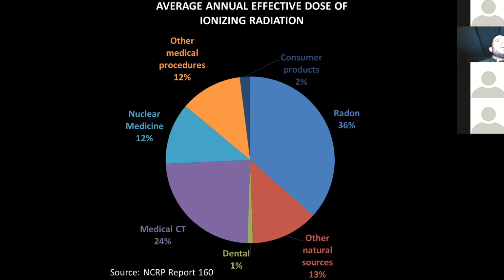So my assumption here is this is talking about ordering bite wings primarily for caries detection. My recommendation is to web search ADA radiographic selection criteria. So American Dental Association radiographic imaging selection criteria, and read it. It's a handful of pages. It's quick. And if you're really in a hurry, find the one table on that document, and it will outline a recall, an indicated or recommended recall schedule for bite wings specifically for caries detection.